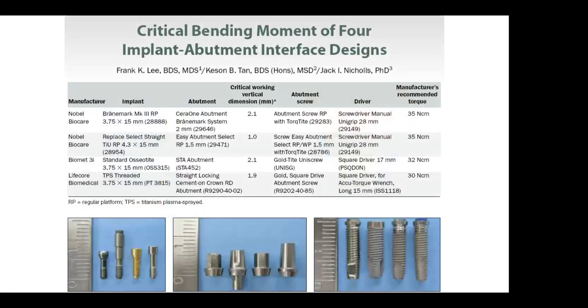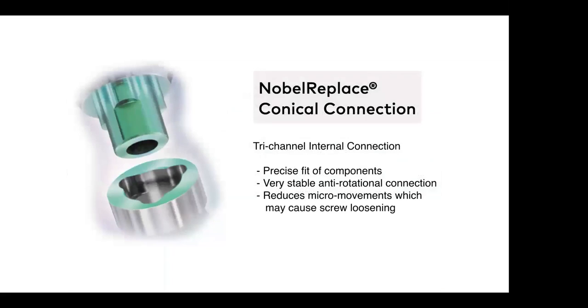There was a study from a long time ago which revealed internal connection seems to resist much better against lateral forces, which is kind of obvious. In this study, they tested 3 external connections and 1 internal connection with lateral force. The internal connection they used in this study happens to be the Replace system from Nobel Biocare.